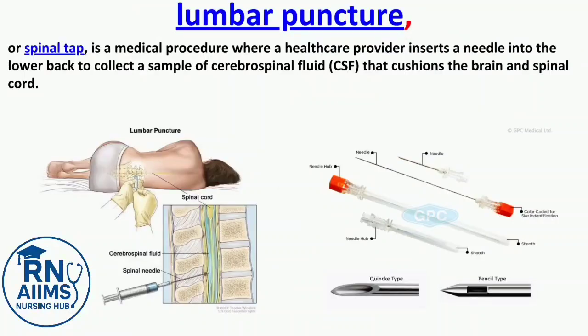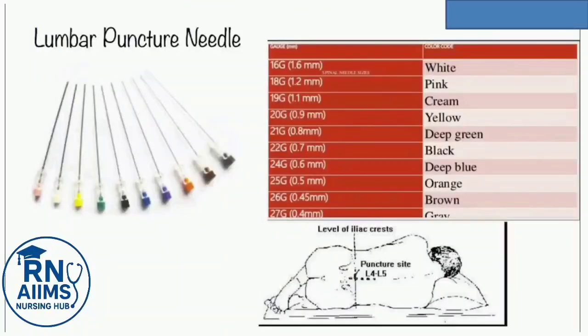Lumbar puncture or spinal tap is a medical procedure where a healthcare provider inserts a needle into the lower back to collect a sample of cerebrospinal fluid, CSF, that cushions the brain and spinal cord. Lumbar puncture needle and their size and color code.